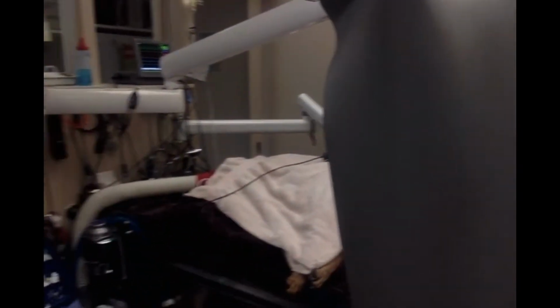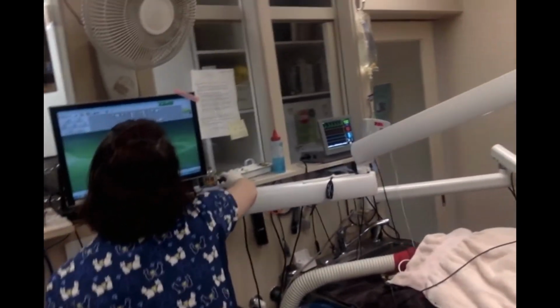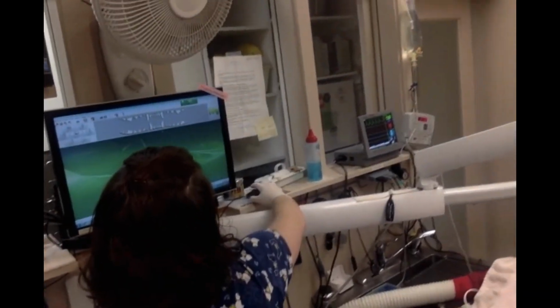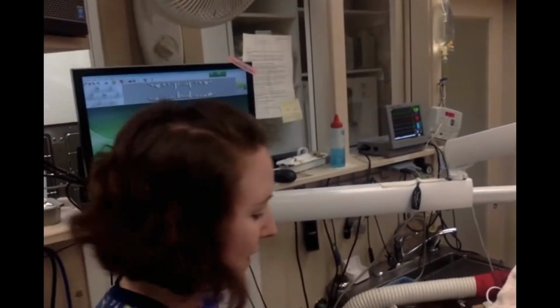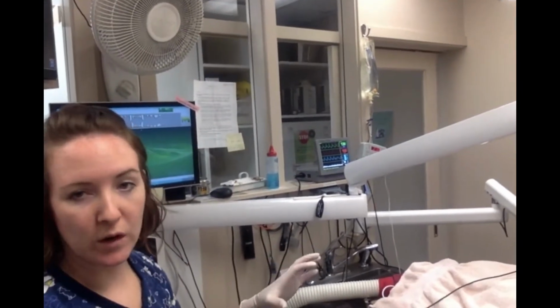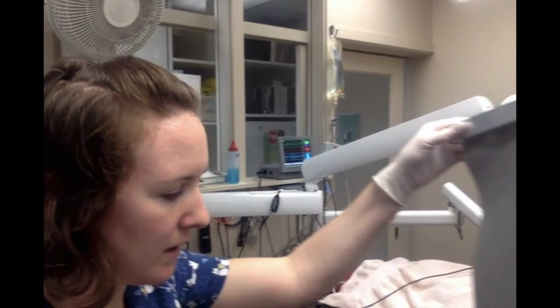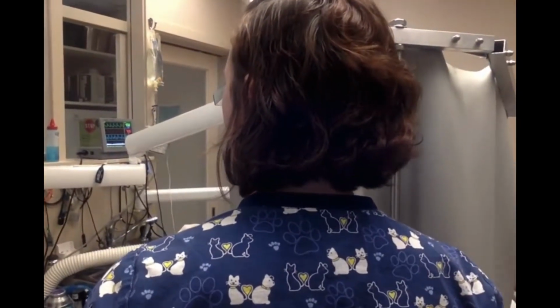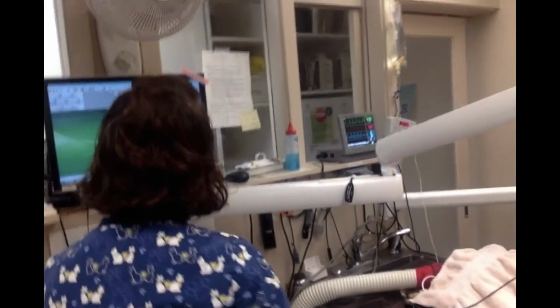And I also have to come over, we have a digital radiography system here, so I'm going to select the teeth, and I can select any of the upper incisors, and it'll kind of focus on what area I'm using. And this machine luckily also sets the kVp for us, senses the power, and then we'll adjust accordingly. So I'm going to hide behind my shield here. We're going to take an image. Okay. It should show up on the screen.